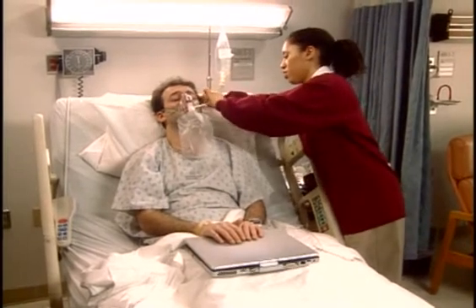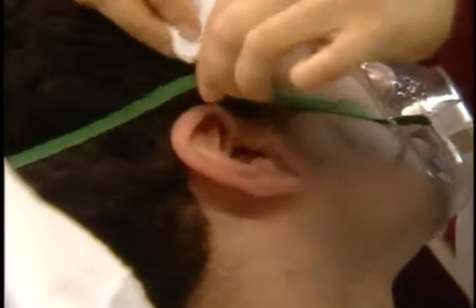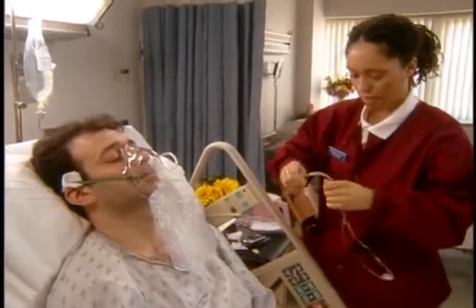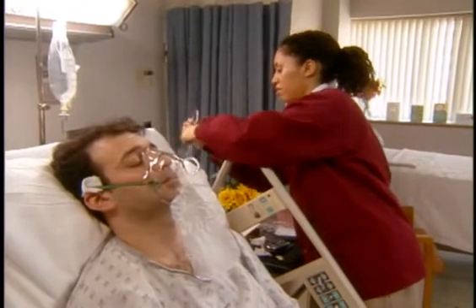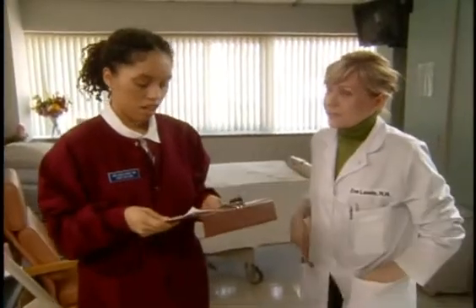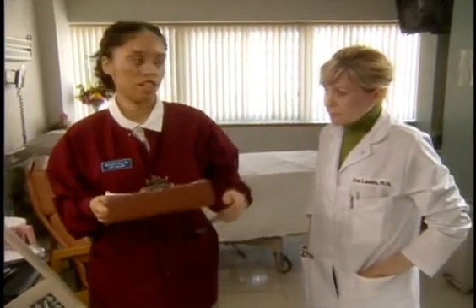It's here to protect your ears. Can you look at me? How's that feel? All right? That's it. Okay, everything looks great. So I'll document, including my assessment, the type of mask used, liters per minute flow, and the patient's reaction to the procedure.